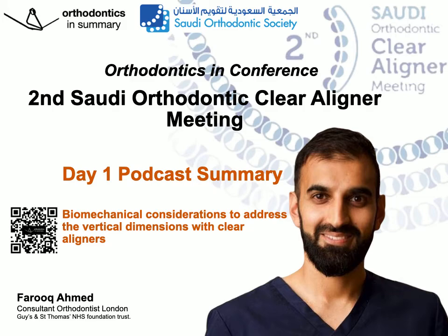Then carrying out the IPR. Now he mentioned IPR is counterintuitive because we retract teeth and we can therefore extrude them. But the idea of staging it means we've achieved our proclination, our relative intrusion, and then we're going to do our IPR, reducing the amount that's therefore needed. Now this is round tripping in the most clear sense. However, Maz stated that if we fundamentally finish the teeth in a more lingual position, the periodontal tissues should be fine. Next was staging from a vertical perspective.